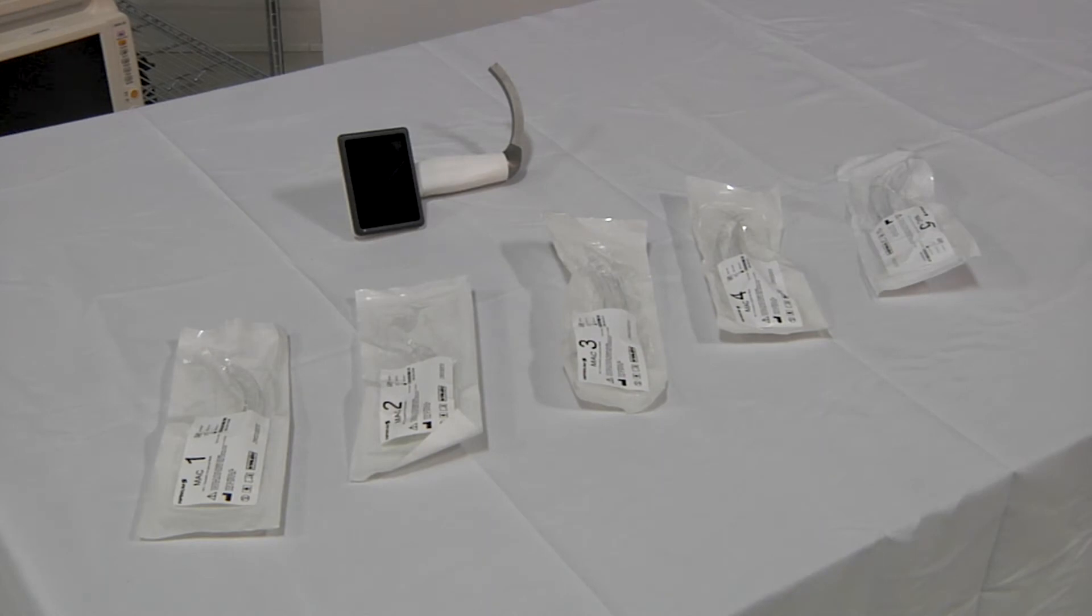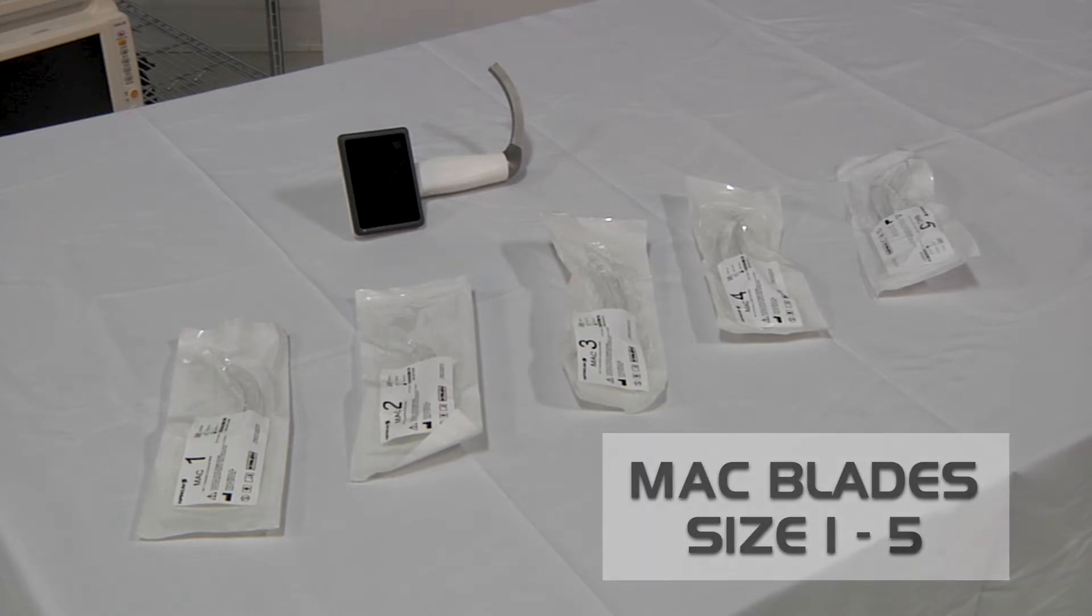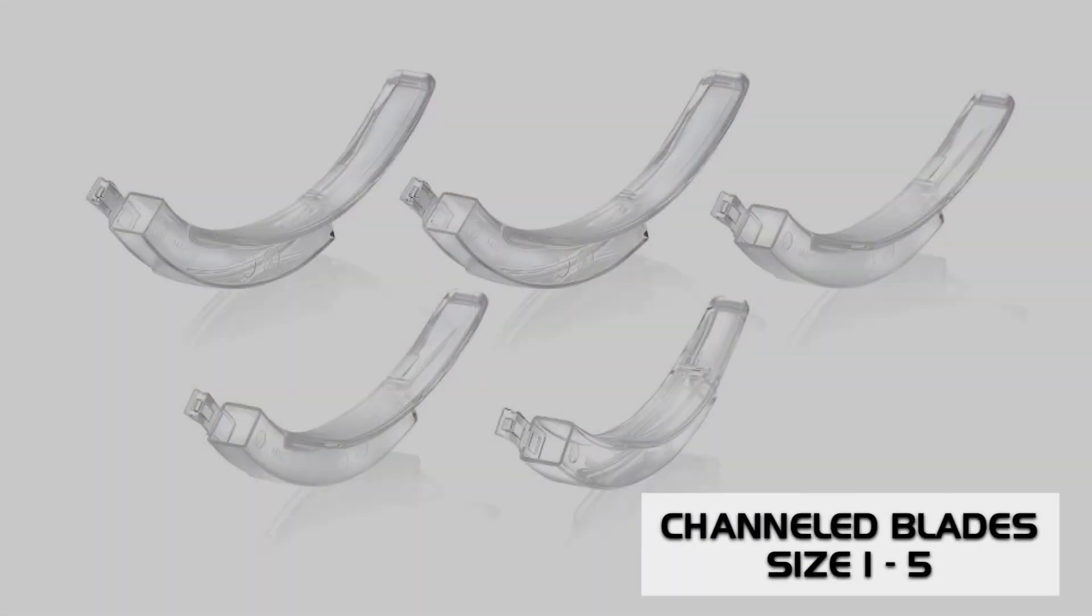This is the main unit of a laryngoscope using disposable blade covers. We have 10 blade cover sizes available: MAC size 1 through 5 and channeled blades size 1 through 5.